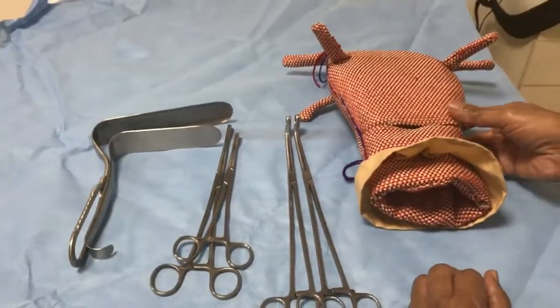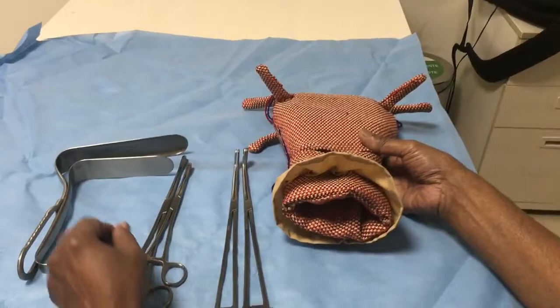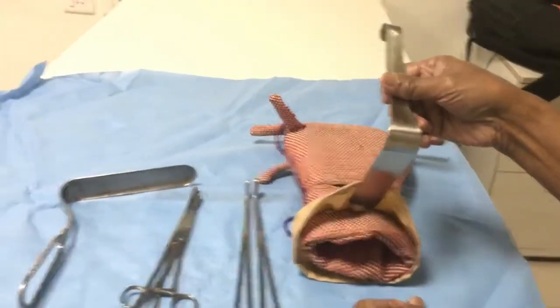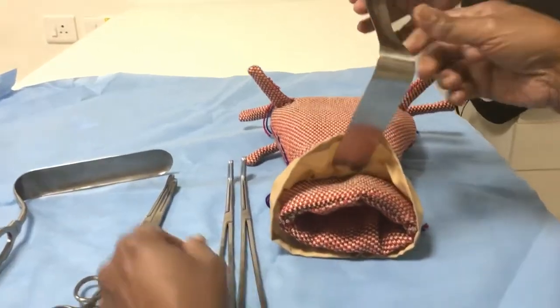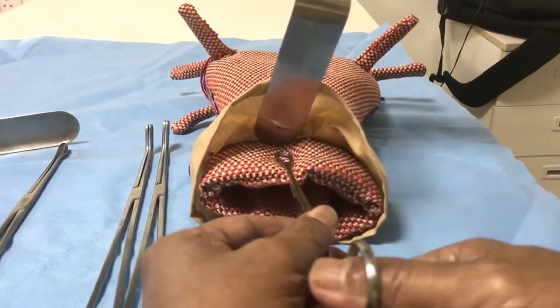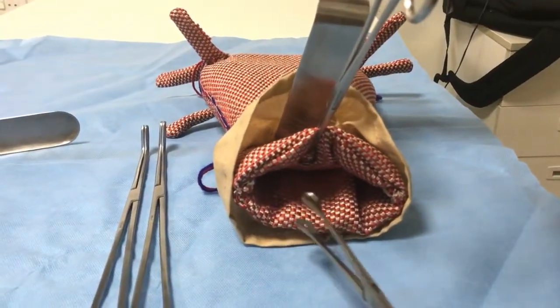In case of profuse bleeding from an atonic uterus, you first expose the cervix using retractors, then use a sponge holder to catch the anterior lip of the cervix and another one to catch the posterior lip of the cervix.